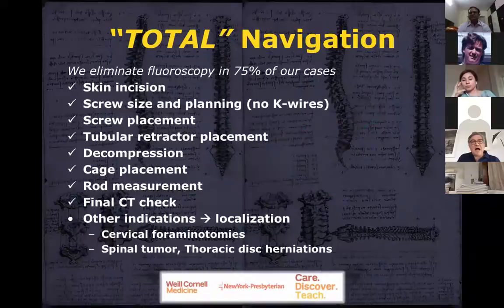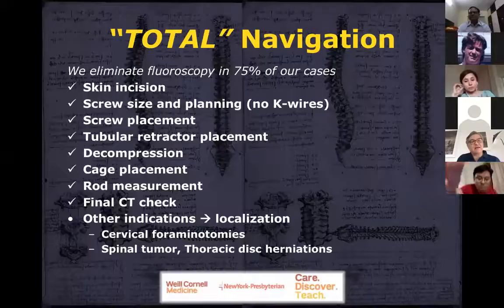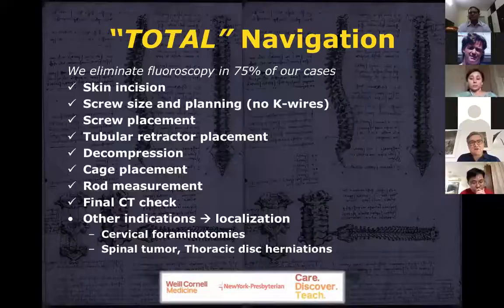As I walk you through my workflow for MIS TLIF surgery, you will realize that I use a lot of navigation. I know that navigation is not available to some of the participants of the course at this point. Maybe some of you have it already. However, I know that the technology is evolving, and more and more surgeons are going to have it available. That's why I want to give you an idea of how to integrate navigation into your MIS TLIF surgery, and into most of the fusion procedures that we do, and even some of the decompression procedures.